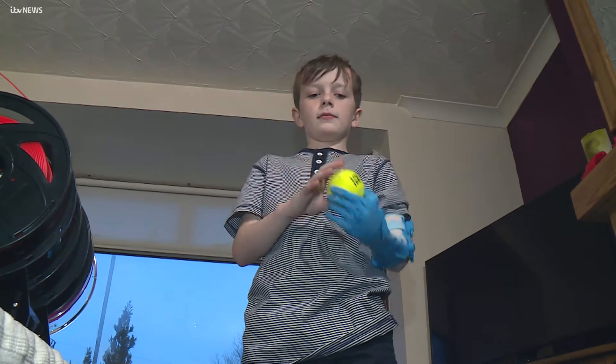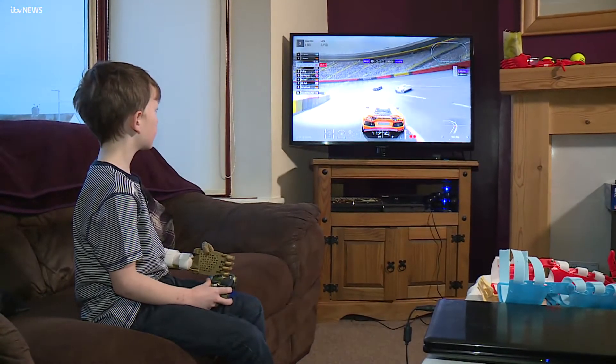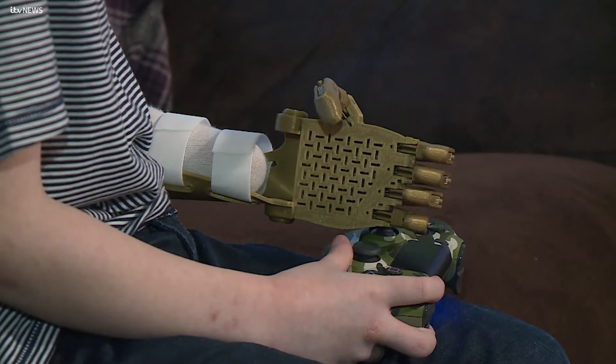It isn't the easiest thing to do, but then you get used to it and you know what you can pick up without breaking all the fingers off.